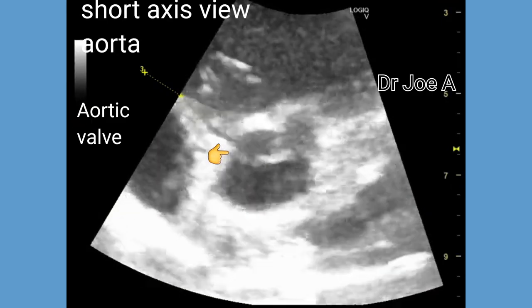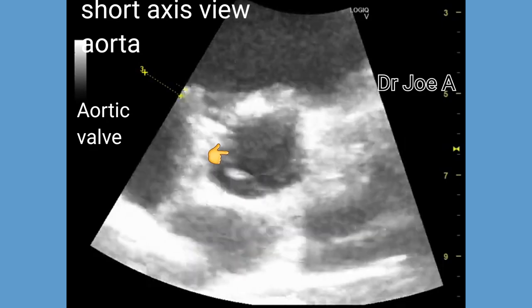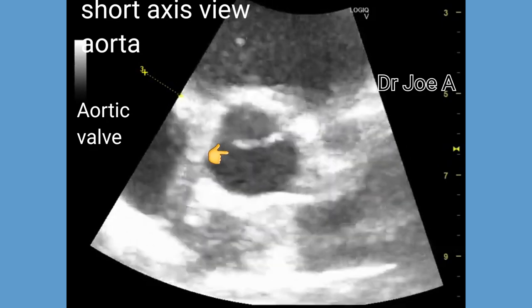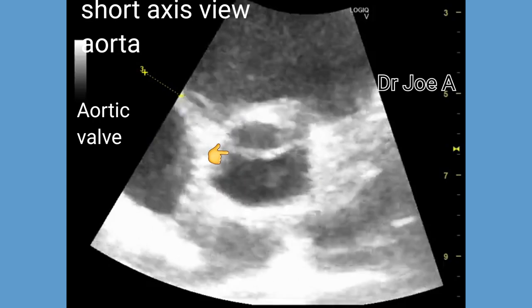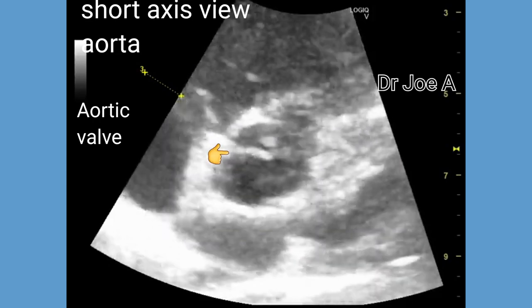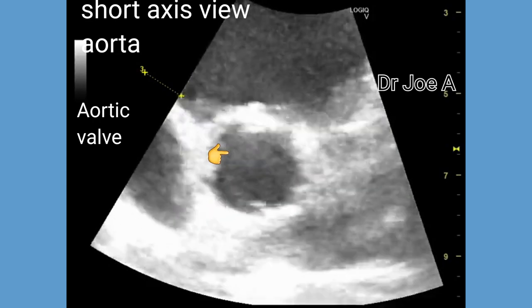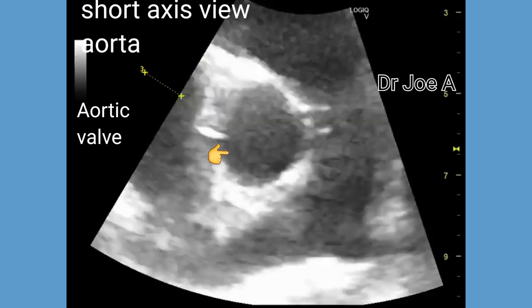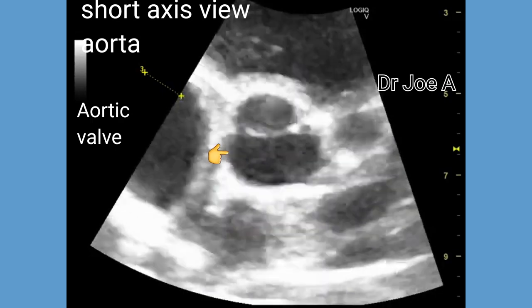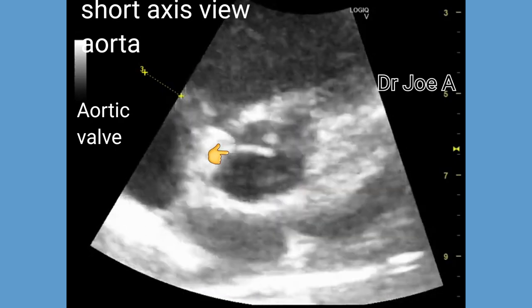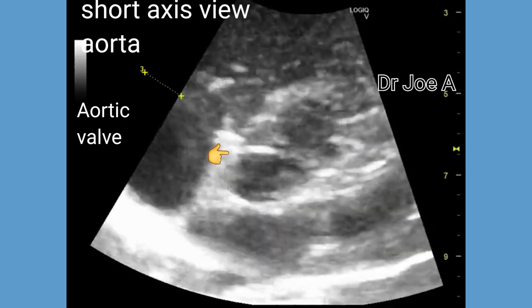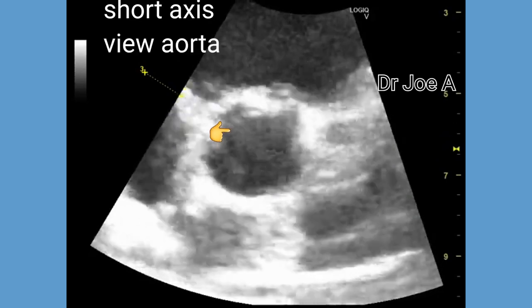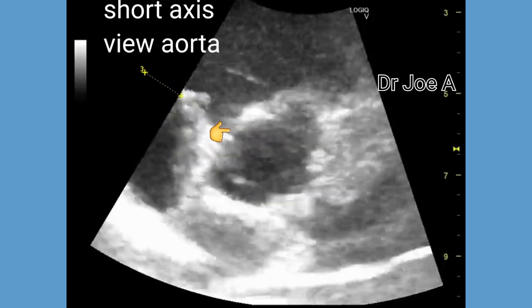Next, we study the aortic valve in the short-axis view. In this case, there are three cusps of the aortic valve, and hence it is a tricuspid aortic valve, which is normal. In some cases, and quite rarely, we may see two cusps or even four cusps of the aortic valve.